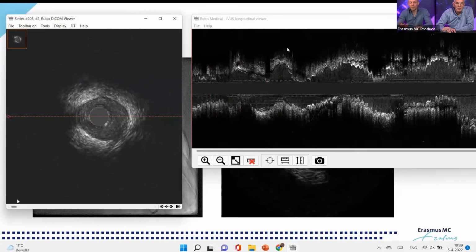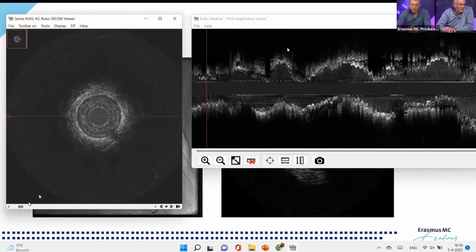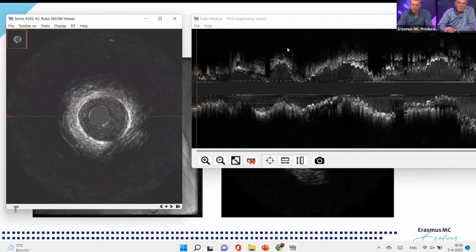Because when you're scrubbed in, it's simply not that easy to scroll through all the IVUS images, and you need to learn how to talk to your technician, to teach them what is distal, what is proximal, what is the lumen, what is the vessel area, and so on. And only then can you really make this a swift and tailored approach that will help you to guide your PCIs. And that starts with the standard protocol for all your IVUS cases. Study or no study, whatever vessel it is, you start with the same thing. And that makes things really easy.